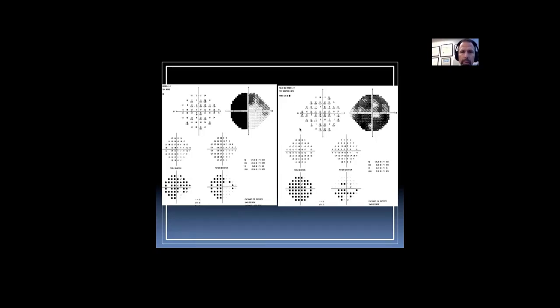Is there a specific field defect in normotensive glaucoma? I don't think I would say specific, but I tend to see patients with normotensive glaucoma who've got what look like sort of central scotomas, but they split fixation. So they're these small scotomas that split fixation either inferiorly or superiorly. And they're sometimes sent to me as, gee, hey, this doesn't look like glaucoma. But in my experience, that's by far the most common type of field defect I see with low tension glaucoma.